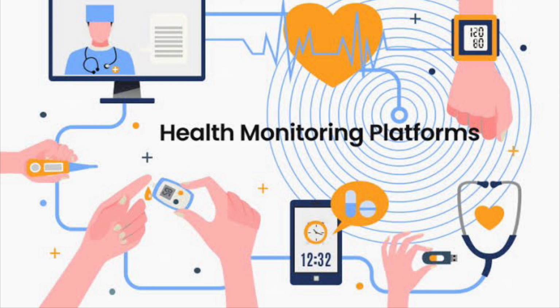or it is not feasible for somebody to go through this large amount of data and monitor a large number of patients. And second, if it's remote monitoring, then one has to identify the subset of patients that needs to be monitored, such as patients who are sent back from hospital after surgery. But naturally the problem is somebody has to monitor whether the wearables are used properly, because if any lead comes off, then naturally it will raise a false alarm.